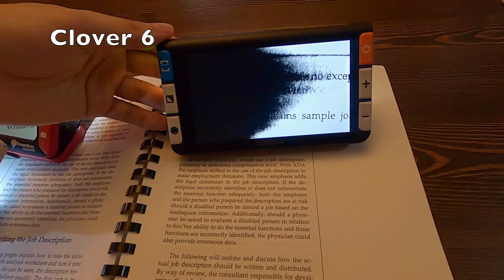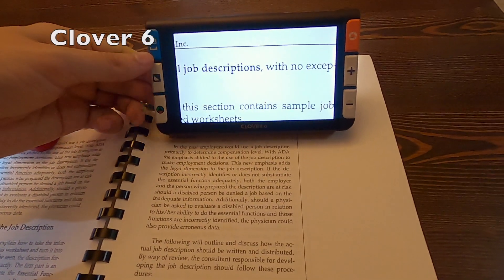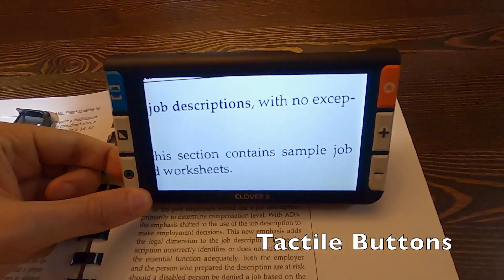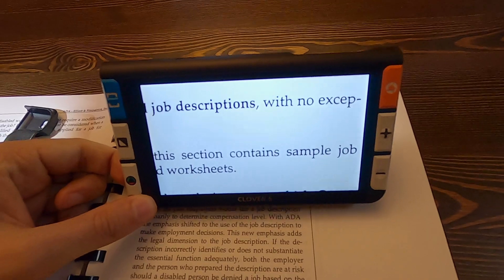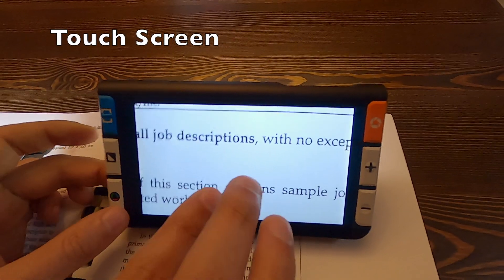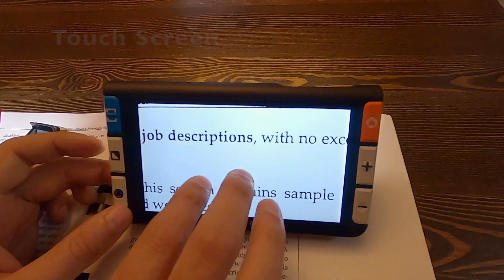And then finally we have the Clover, and this is kind of where we went back a little bit to some more cartoony buttons, but they're not as childish as the Candy or the Pebble. Very tactile buttons, super crisp screen, and it pinch zooms.